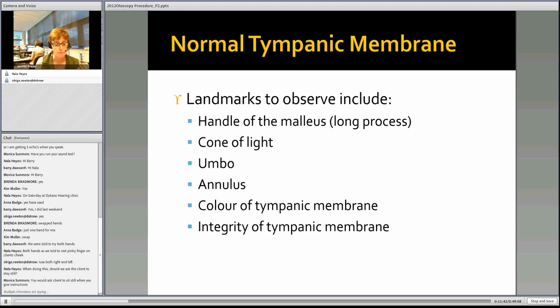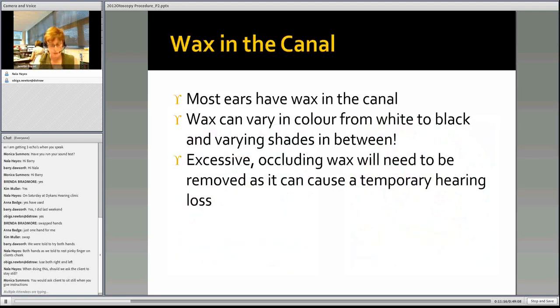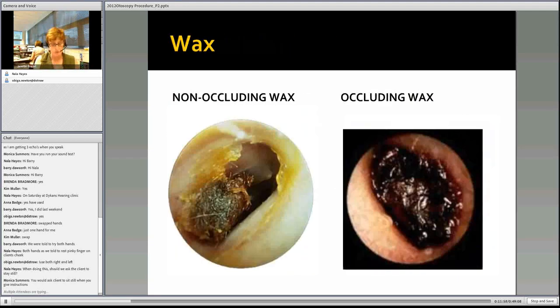And basically the person looking in the ear touched the side of the ear canal with the speculum, and it actually touched their vagus nerve, and that person went into a dead faint, and they sort of slipped away onto the ground. Now, if the person hadn't been anchoring their hand properly, they would have injured that person as they went down.